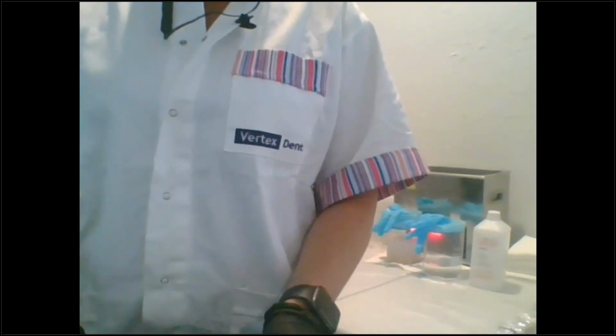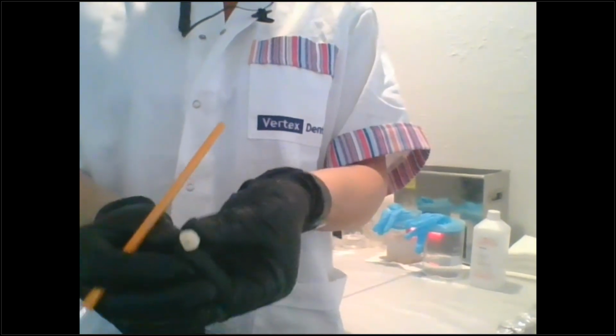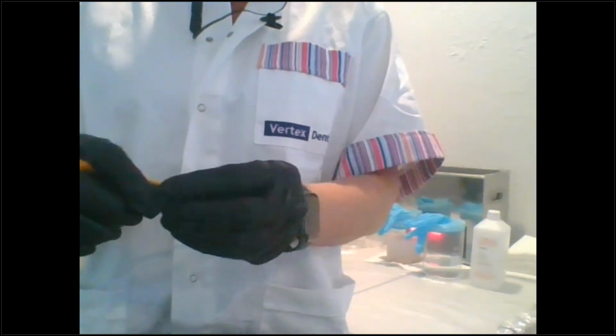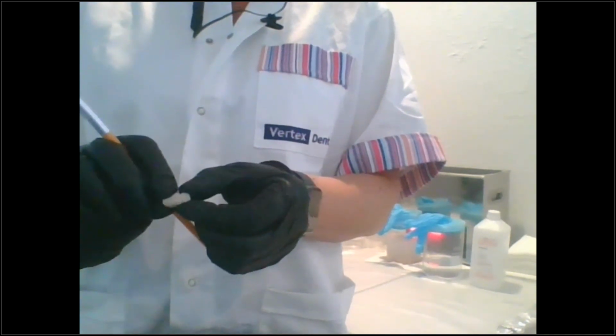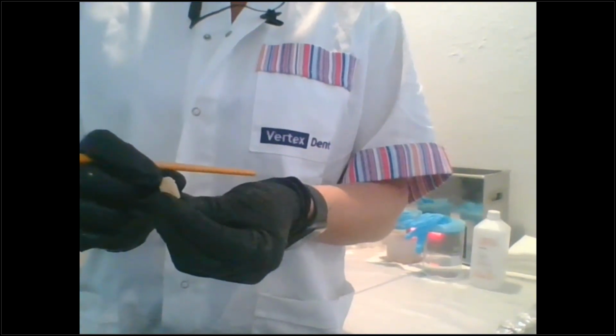You can do a few different things. So on ExoCAD, you can have more of a geometric shape. I don't know if you can see that. It's not very clear, but it doesn't follow the shape of the margin. It's more of a geometric shape, so it has flat edges. Or you can have it follow the contour of the margin.